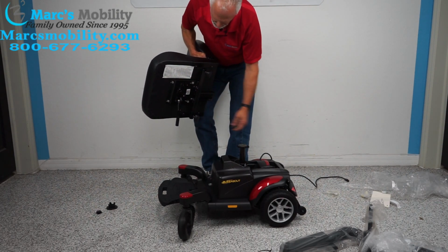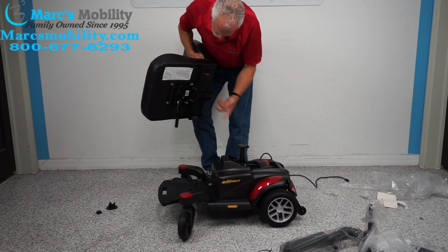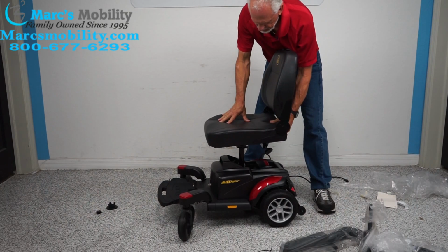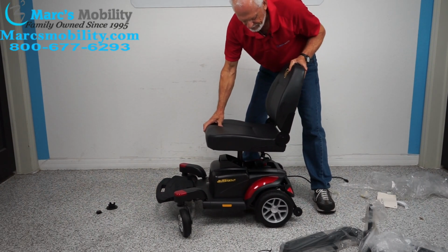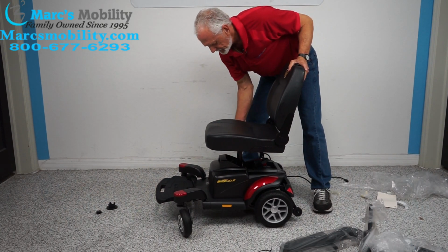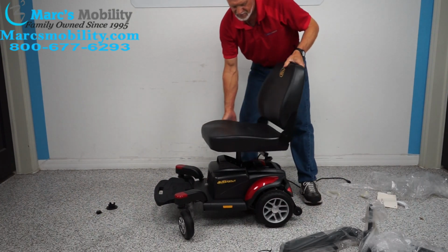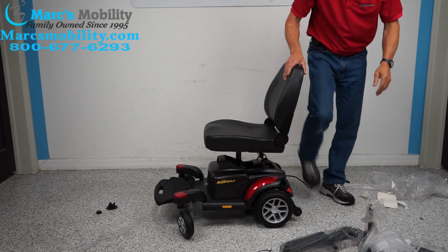Pull the cap off of here. And I think we just put it on and it just drops on. Let's just see if that's what happens. Yep, it's already locked. There's a handle so you can swivel the seat. The handle's under the right side. So we've got the seat on.